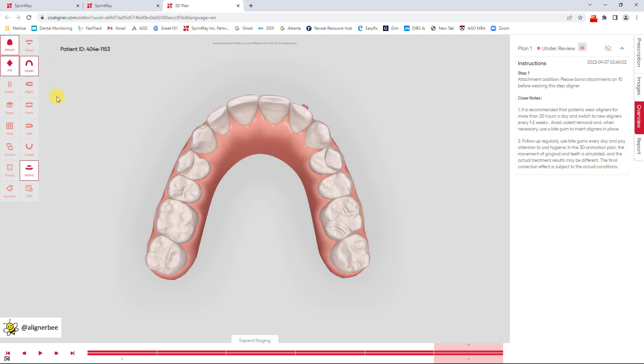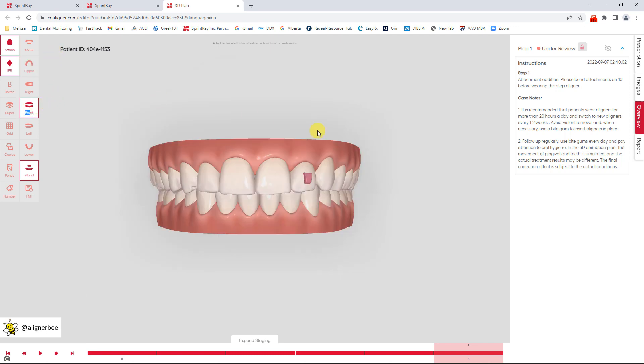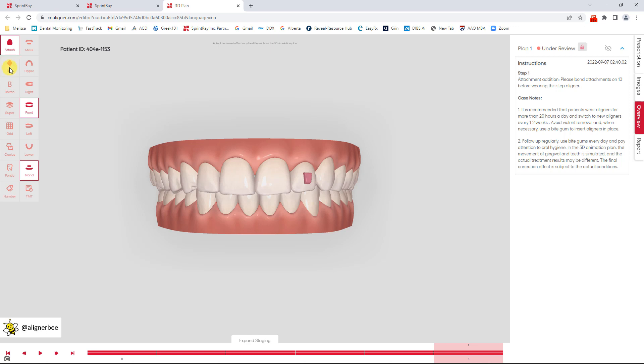So overall I was really pleased with the treatment setup I received. The technicians did a great job of following the instructions I gave. We can see here that I do have an attachment on my upper left lateral. If I go to the attachments tab I can toggle that on and off in case I wanted to show it to a patient. This patient doesn't require any interproximal reduction but if they did I could turn that on and off as well if I was showing it to the patient and didn't want it to be a distraction.